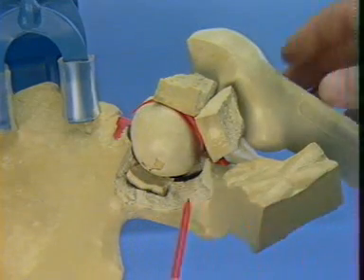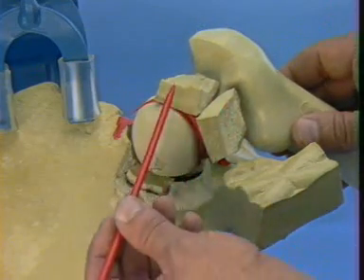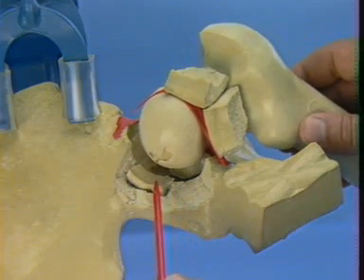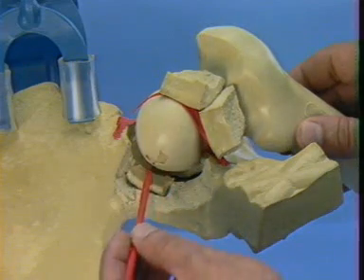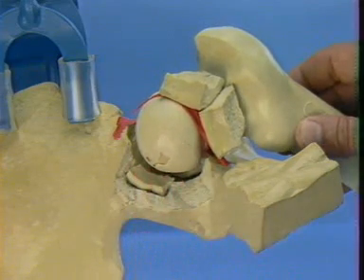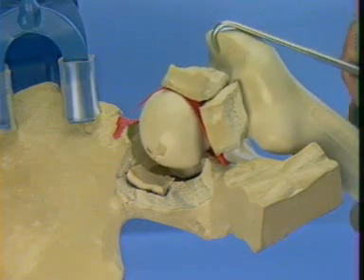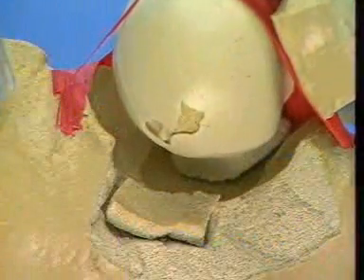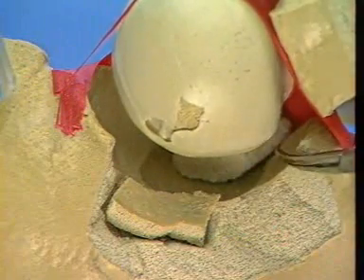We can see the fractured cancellous bone surface where these fragments came from. An impacted segment of the cartilage of the posterior wall is visible in the fracture site. The femoral head is distracted from the acetabulum to visualize into the joint. The joint is cleaned and intra-articular free fragments are removed.